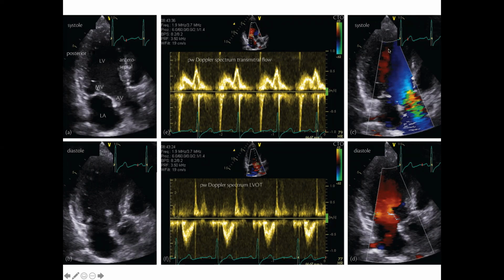And here you can see there is red stuff, right? In this part of the left ventricle, which is still flowing this way, and this stuff has turned the corner and is flowing back, so it's like a swirl, right? And this stuff's getting pushed out the aorta.